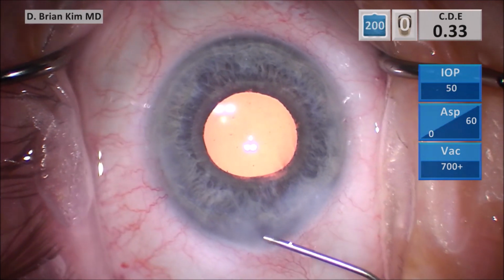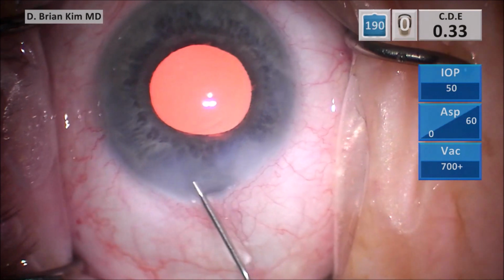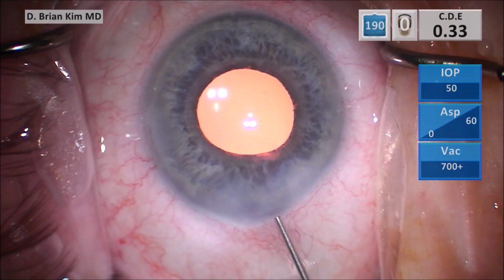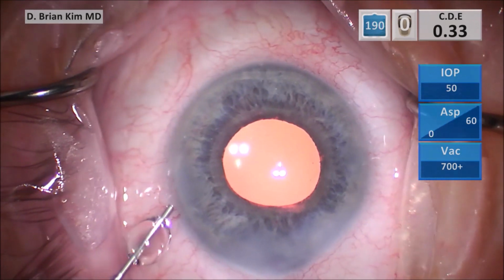And when you confidently get underneath the anterior capsule, underneath the epinuclear material, you can do mechanical fracturing, placing your chopper out to the equator, doing mechanical fracturing forces to crush the lens pieces between the chopper and the phaco tip. And in my mind, this is the best way to do cataract surgery.